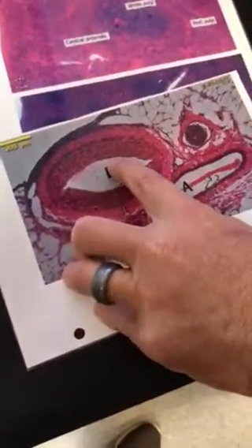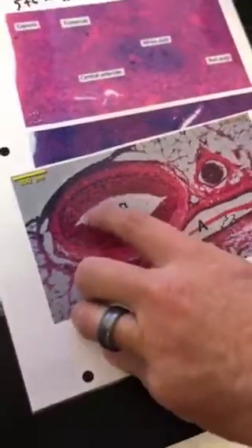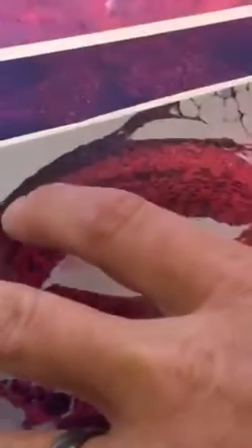This is an artery because it's thick-walled. This is the tunica intima, media, externa.